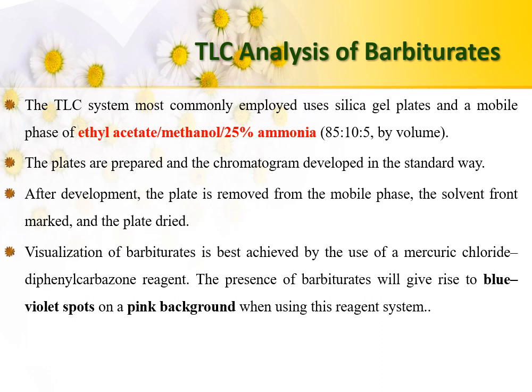Once the barbiturates and benzodiazepines are confirmed in presumptive tests, then thin layer chromatography analysis can be carried out. The TLC system most commonly employed uses silica gel plates and a mobile phase of ethyl acetate, methanol, and 25% ammonia for barbiturates. The plates are prepared and the chromatogram developed in the standard way.